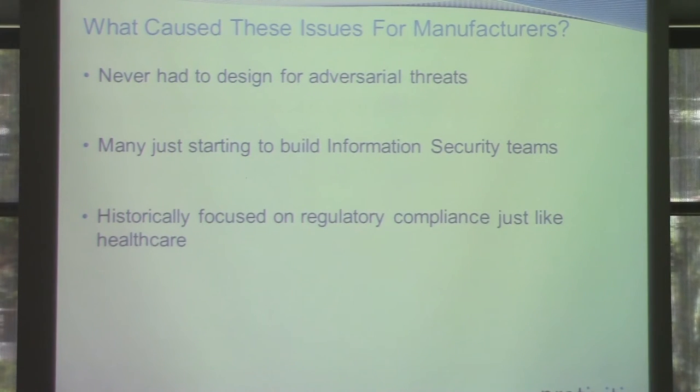Has anyone heard of the Therac 25? The Therac 25 was actually back in 85-87. They were linear accelerators, and in the first two models they had hardware failsafes in place. Well, in the third model, the Therac 25, they decided, we're just going to use software. We're not going to have hardware failsafes when we're amping up the radiation and ionizing it. Well, what happened is, like six people ended up with adverse patient safety events.